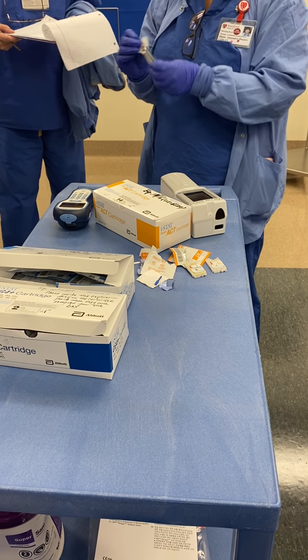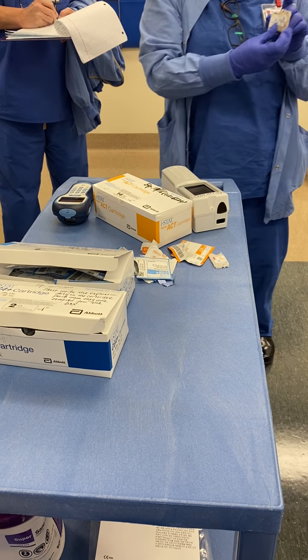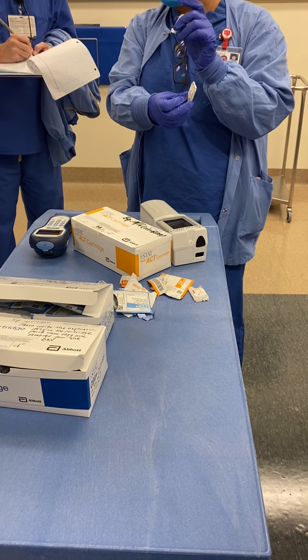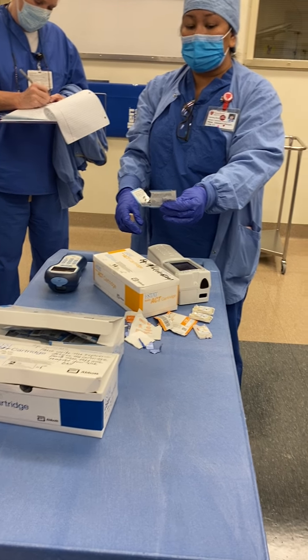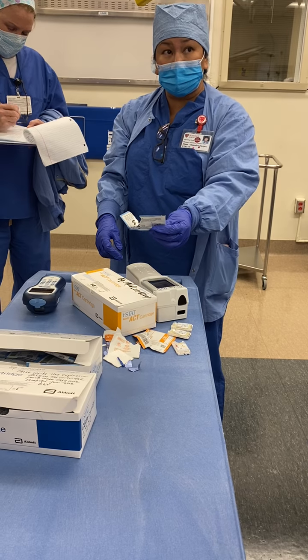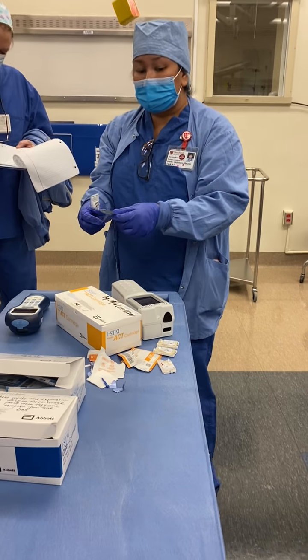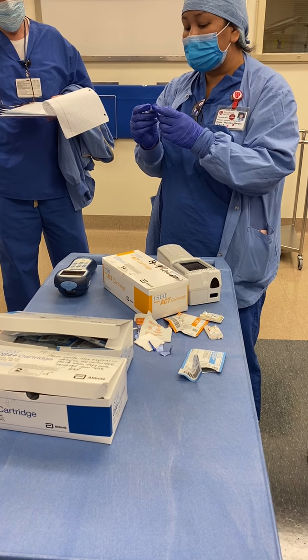This one is good for 2 months. It says CG4, CG8. With CG8, just think of it as having the most lab values that you can get an answer for. Okay, this one does pH, CO2, PO2, sodium, potassium, calcium, glucose, hematocrit, bicarb, base excess, oxygenation, and hemoglobin. So with CG8, you can get all the lab values.